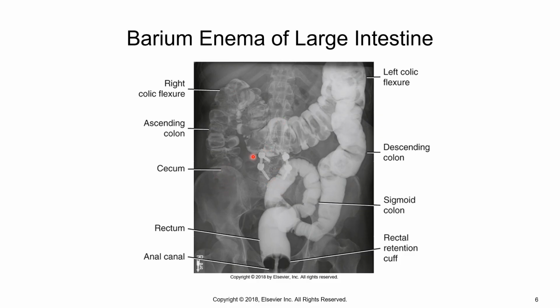Now these bright radiopaque objects, those are actually in the spine. Those are rods that are placed in the lumbar spine. That is not part of the actual exam.